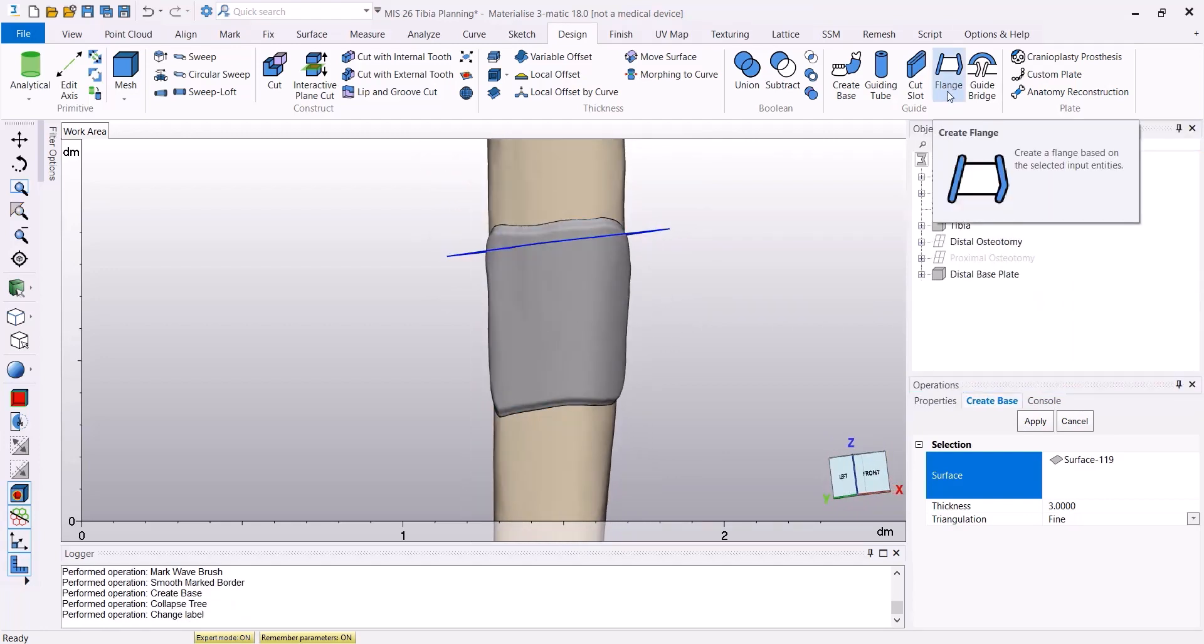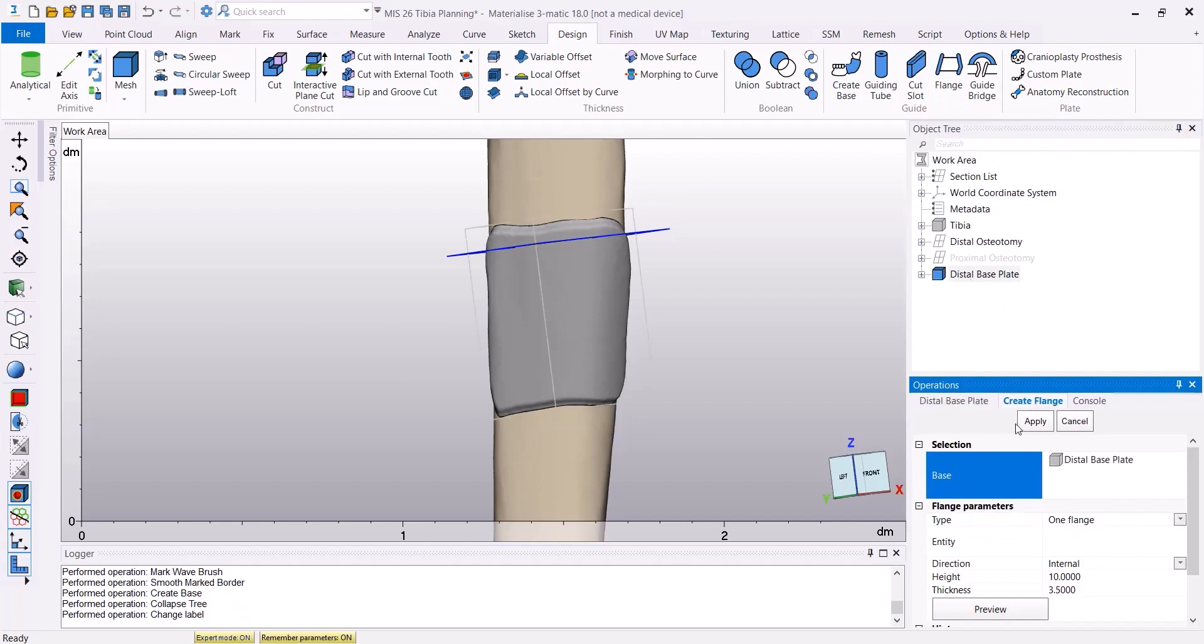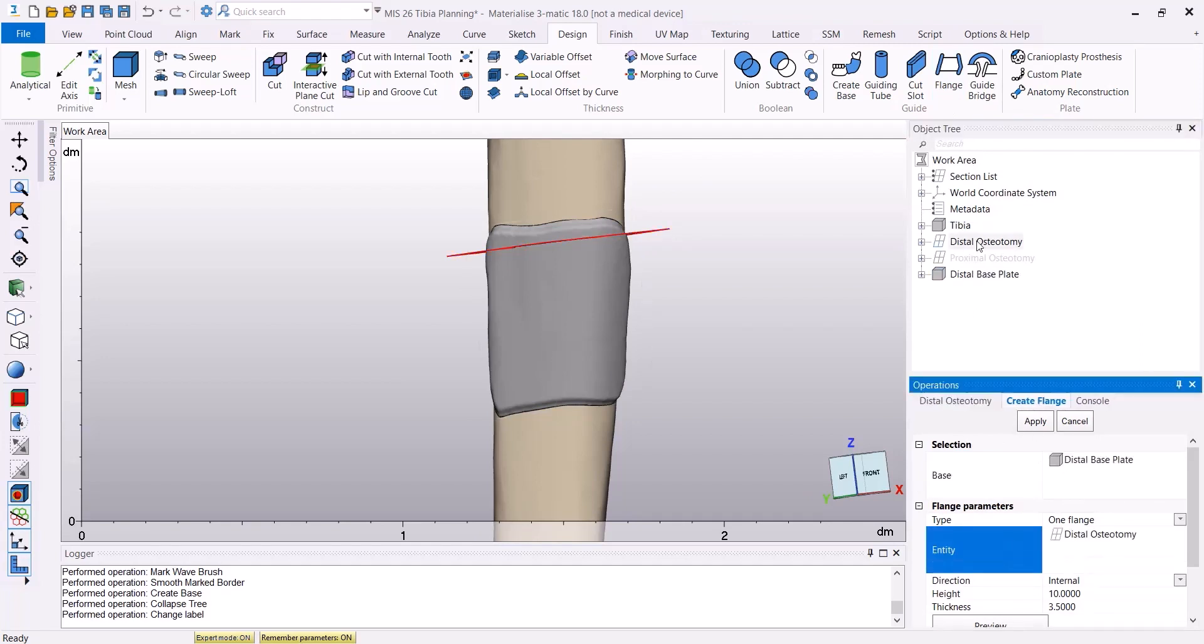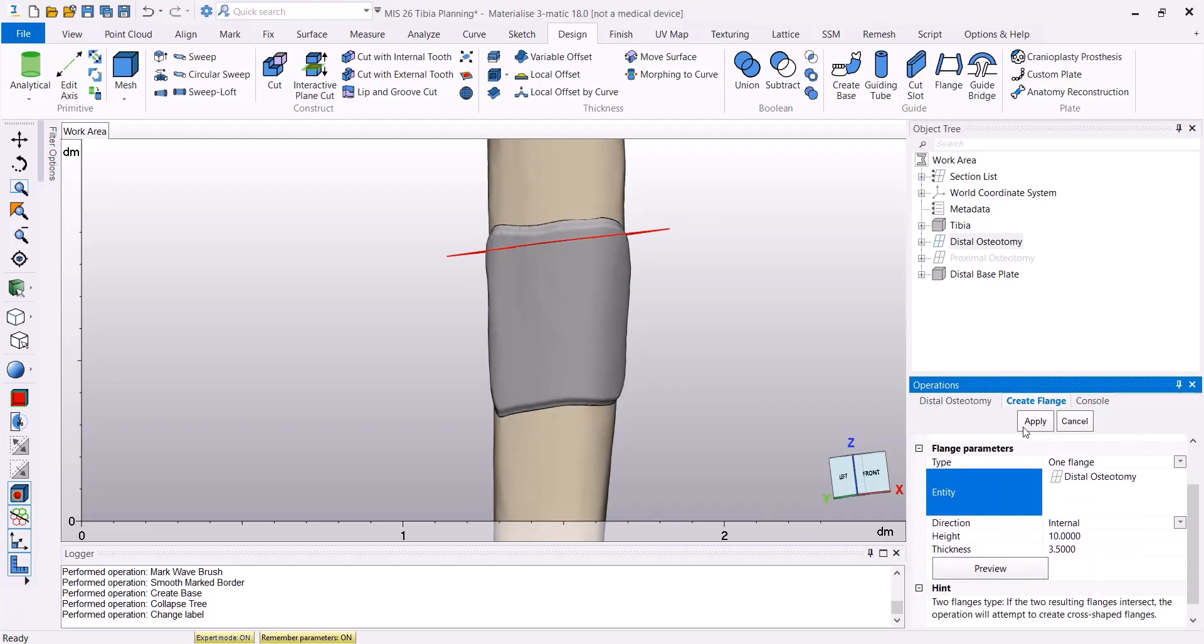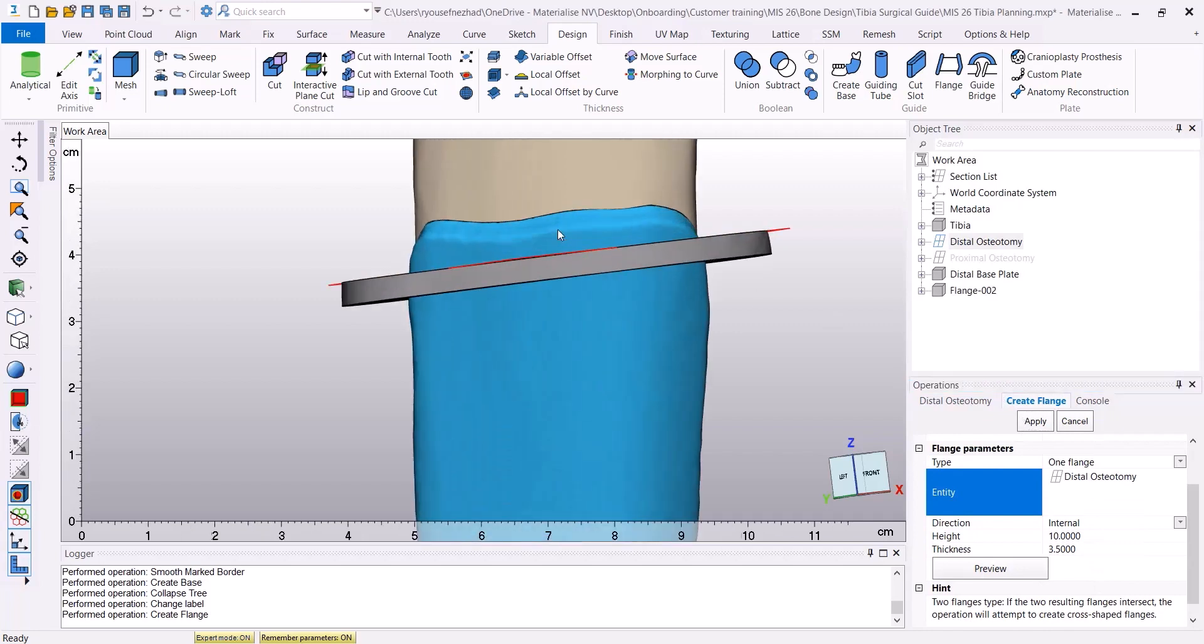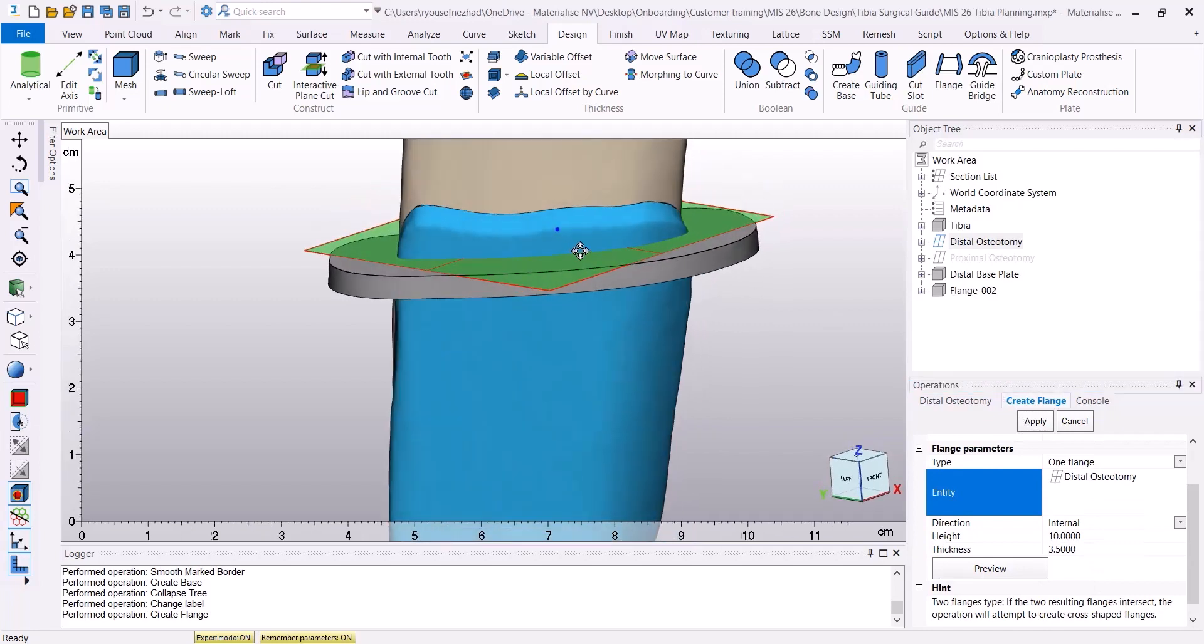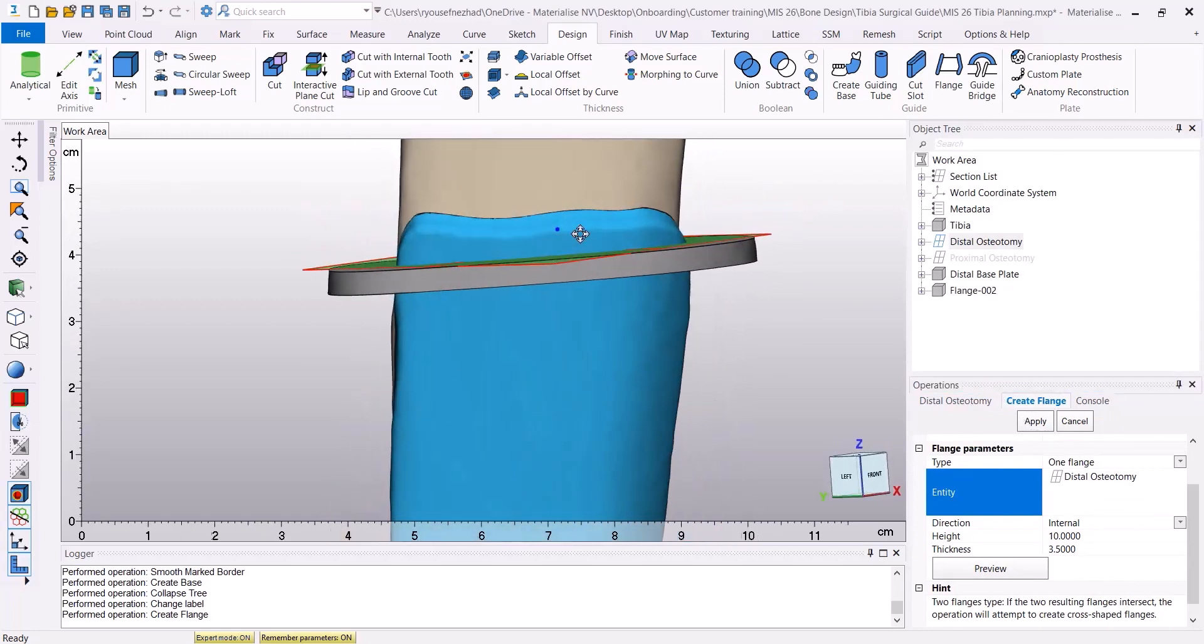Then I'm going to use the flange tool to create one flange, using the distal base as my base, and the distal osteotomy plane as my entity. Then clicking Apply, now we have created the flange on our base.